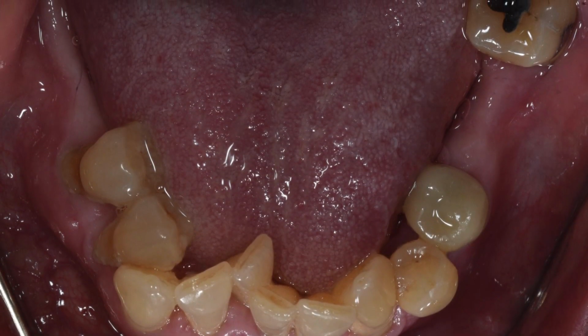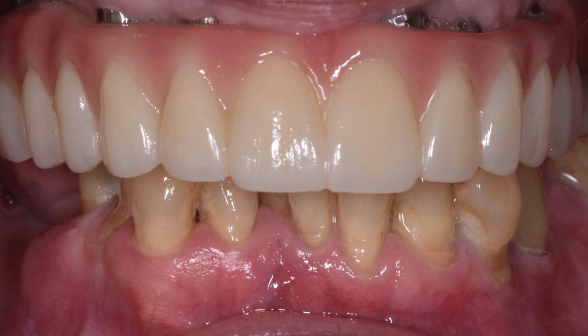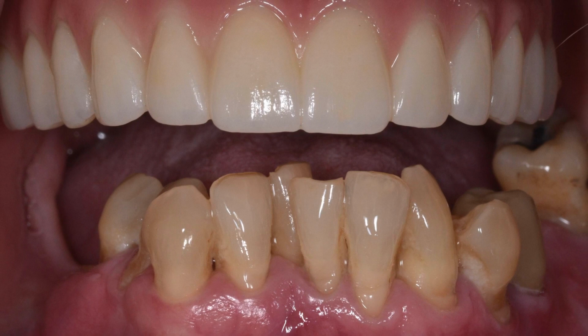And in those occlusal shots, what I'm looking for is literally tissue. Is there any bone resorption that I need to be aware of? Is there enough keratinized tissue? Where's the mucogingival line? Information like that I really want to look into when I'm planning my cases. And that's something that I just don't want to look at in my patient's mouth.